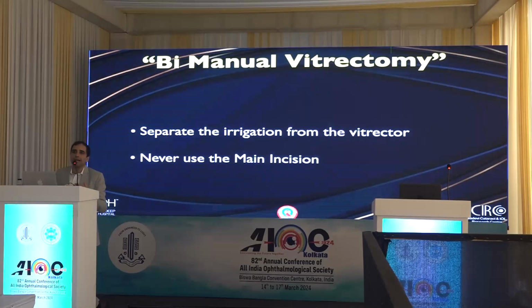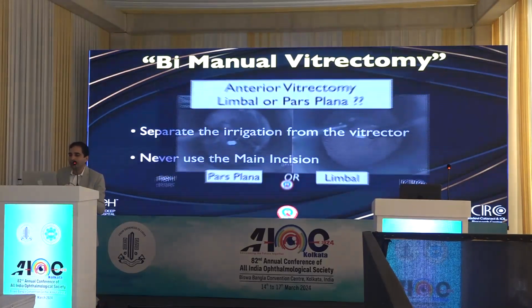And always do bimanual vitrectomy, which means separate the irrigation from the vitrector. So even if you have a machine which has a coaxial irrigation aspiration for cortex removal, for vitrectomy you must have a bimanual system, which is the irrigation and the cutter should be separate.